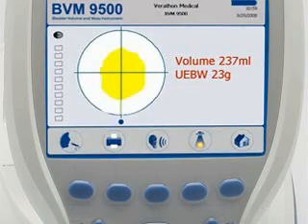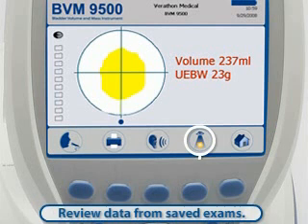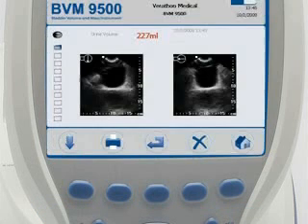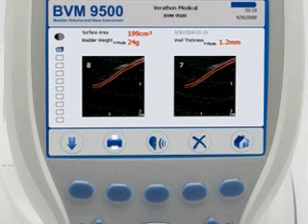After you have saved the exam, you may listen to previously recorded annotations or review data from saved exams. The BladderScan BVM9500 has 2 review screens. Review Screen 1 shows bladder volume measurement results. Pressing the Return button displays Review Screen 2 with data on UEBW, bladder surface area, and bladder wall thickness. If a manual measurement of bladder wall thickness was taken, that data will be displayed on Review Screen 2 as well.